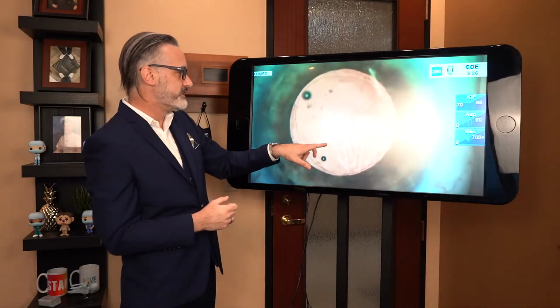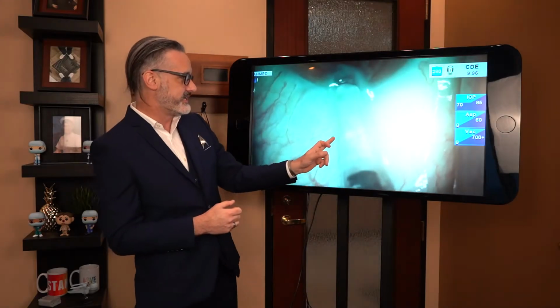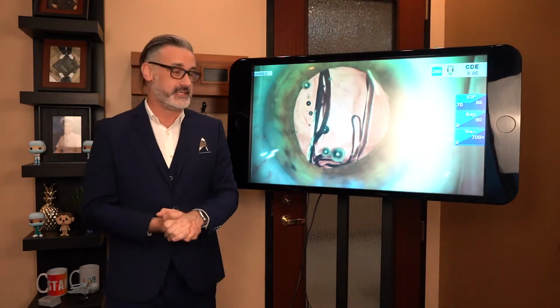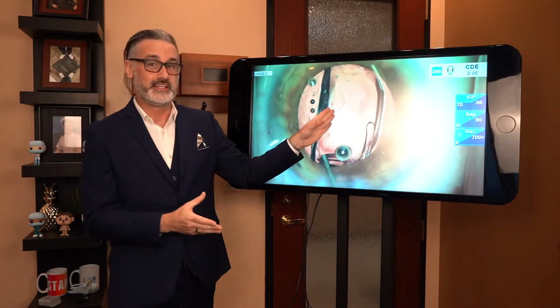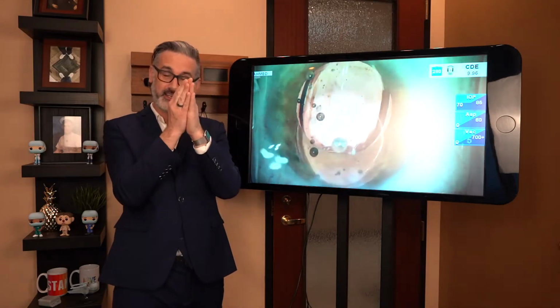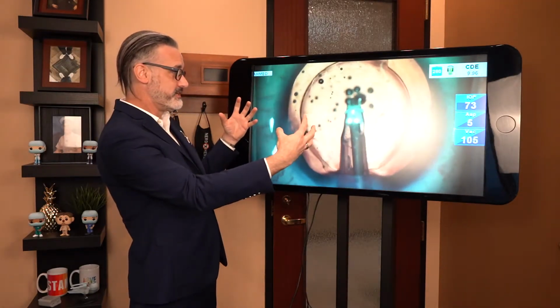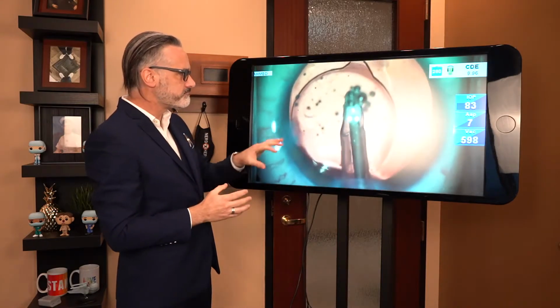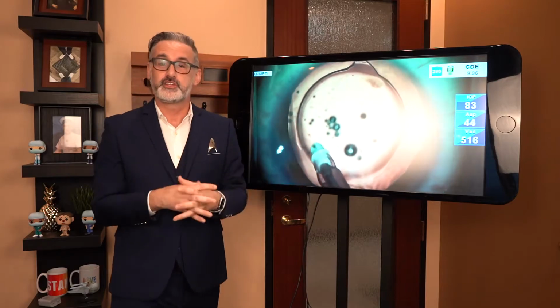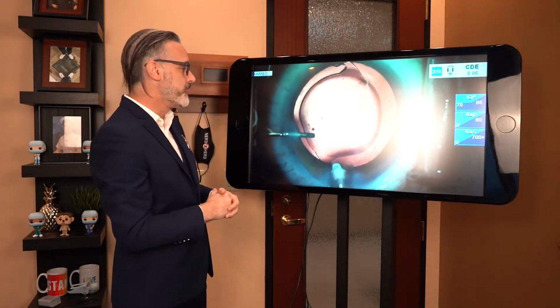And then where the doctor goes then with this tool, they stick it in and then they put it through there. That does look kind of a little bit nasty, but what they did was just put the new lens in. So then we had the one tool that went in, and the lens was folded and small. The tool went in, and then the lens is now being spread out. And it's being all leveled out and spread out to cover the original part of the lens itself, and the original lens that was in.